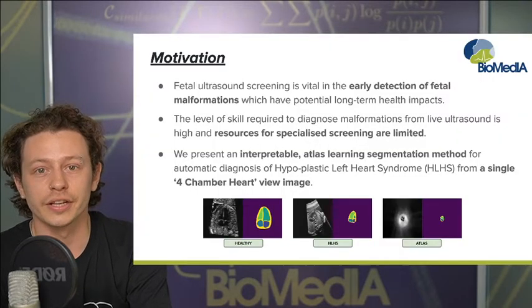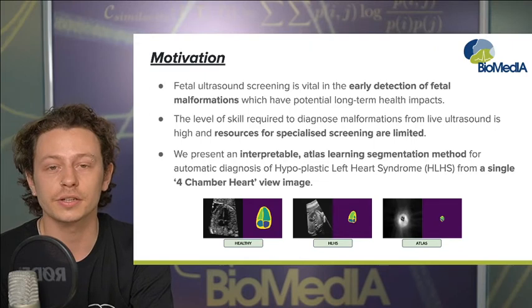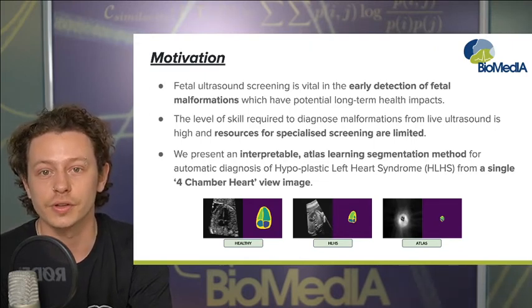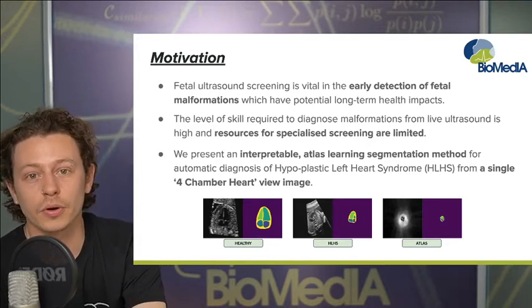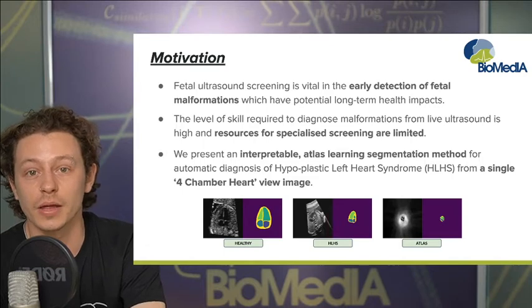Fetal ultrasound screening is a key part of ensuring the ongoing health of fetuses during pregnancy, and the assessment of fetal development and accurate anomaly detection from ultrasound scans are integral in diagnosing potential fetal development issues at the earliest time possible to ensure the best care may be given. During screening, standard plane views are used to acquire images in which key anatomical features may be examined, biometrics extracted, and the diagnosis of developmental issues may be made.